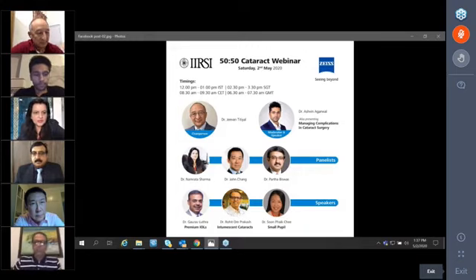Multiple sphincterotomies would be the last choice, and I have not done it for years now, although a long time ago we used to say that as an option. If you have a small pupil, best is to use nylon hooks, and before that there's always a membrane on it, so that can be removed. The Osher's membrane, you can try to remove that.